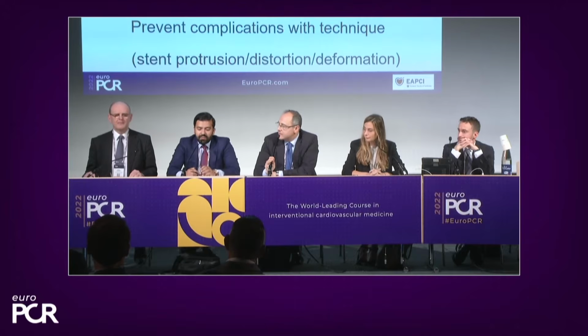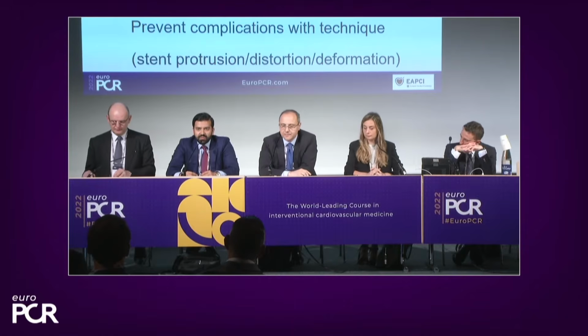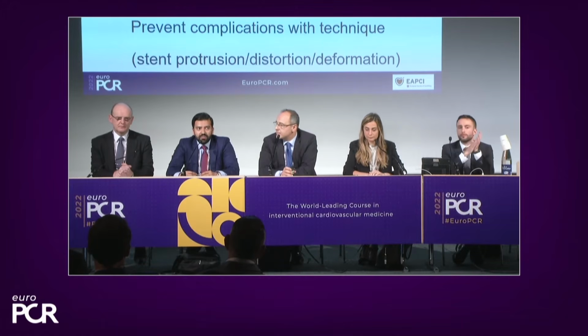Yeah, so I am a heavy intravascular imaging user. So I think Adrian showed the IVUS XPL data. He also showed the ULTIMATE data. There are other clinical trials, IVUS CTO, and there's a consistent message. The message is that there's a 50% reduction in MACE rates and or TLF. And so I think it behooves us to use it in probably one of the highest risk and most important anatomic subsets, which would be left main. So for me, I think it's sort of criminal that if you're not using intravascular imaging to guide your left main intervention, just because the stakes are so high.